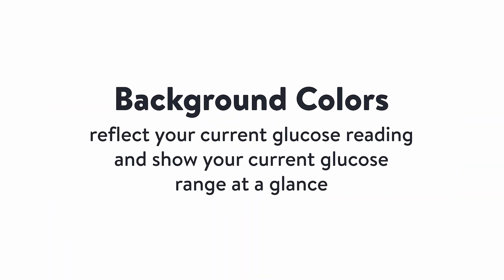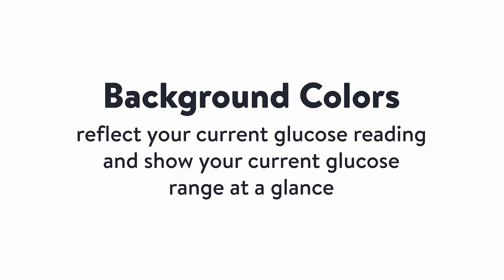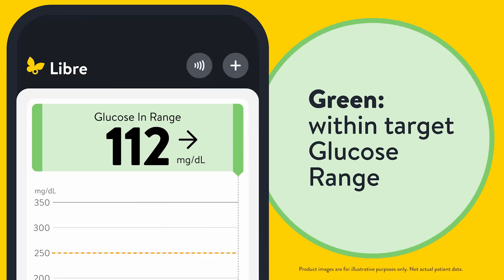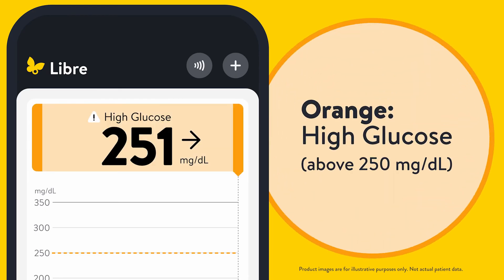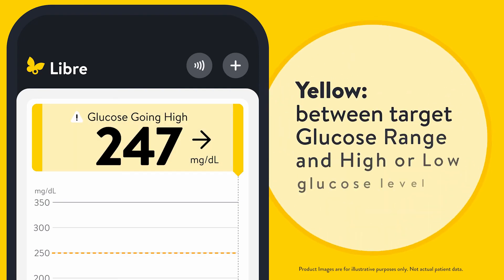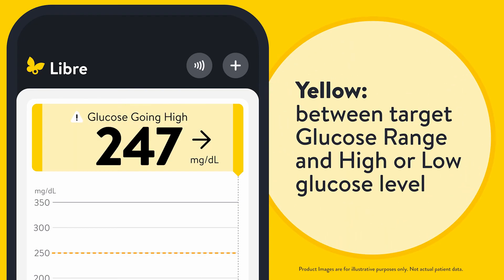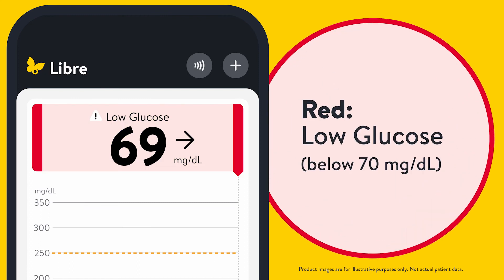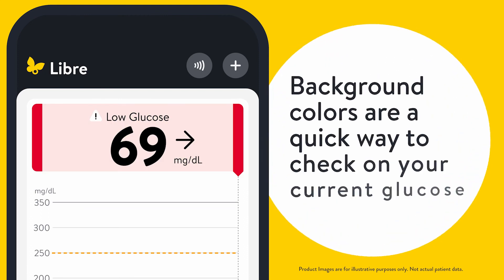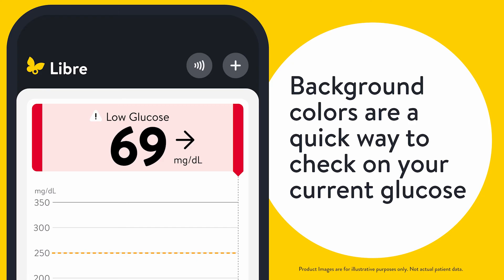Your background colors reflect your current glucose reading and show your current glucose range at a glance. Green means you are within your target glucose range. Orange means high glucose or above 250 milligrams per deciliter. Yellow means between your target glucose range and a higher low glucose level. Red means low glucose or below 70 milligrams per deciliter. Background colors are a quick way to check on your current glucose.